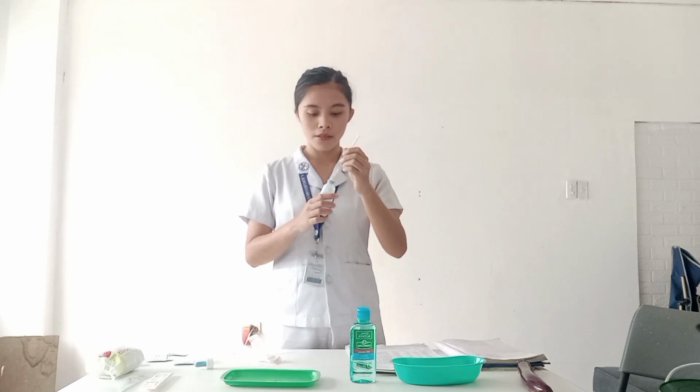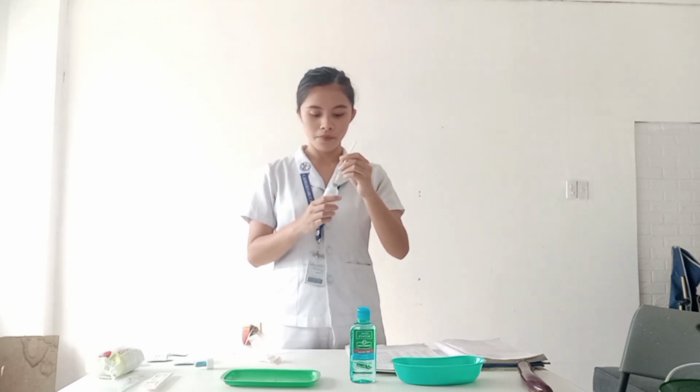Now gradually and carefully insert the needle into the upright vial through the center of the rubber cap, maintaining the sterility of the needle. Now I have to inject the air into the vial, keeping the bevel of the needle above the surface of the medication. The air will allow the medication to be drawn out easily. The bevel is kept above the medication to avoid creating bubbles in the medication.